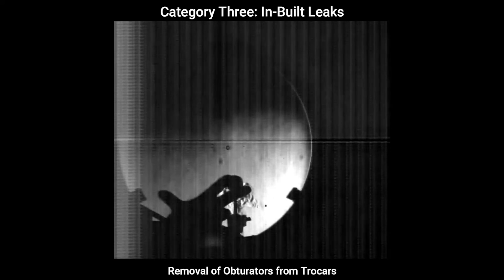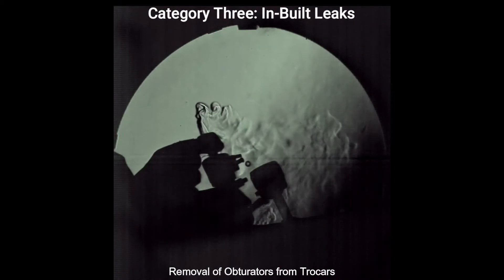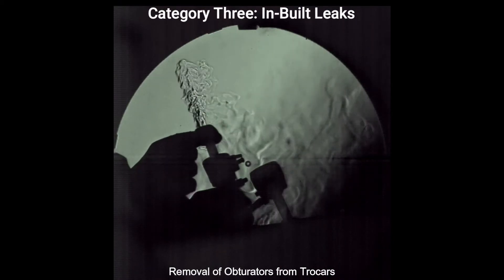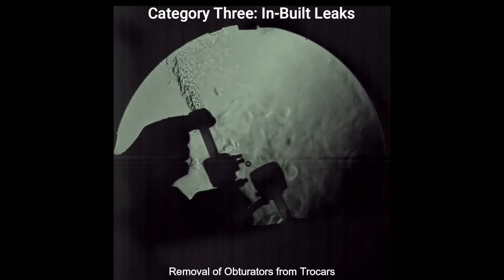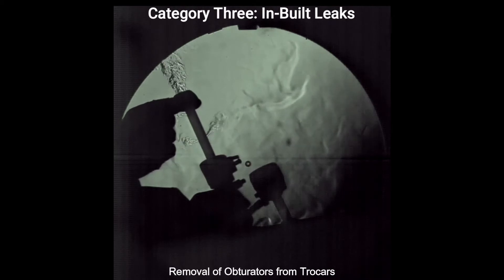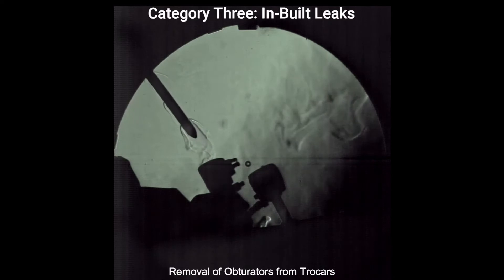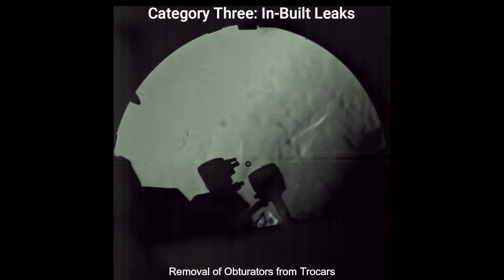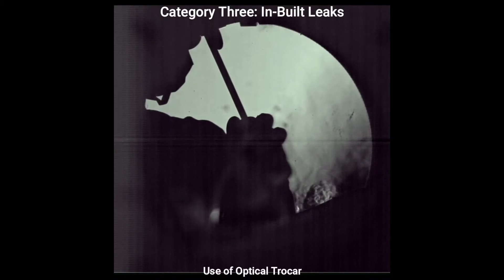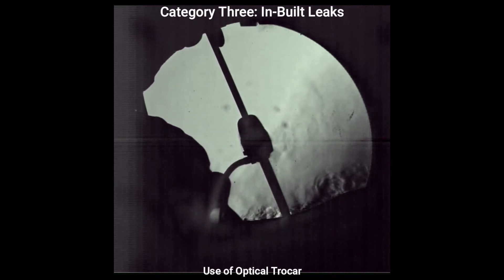Here is an obturator being removed from a 5mm port, which is needed for placement or replacement of trochars. Optical ports, by their mechanism of action, induce a lot of gas flow during their placement.